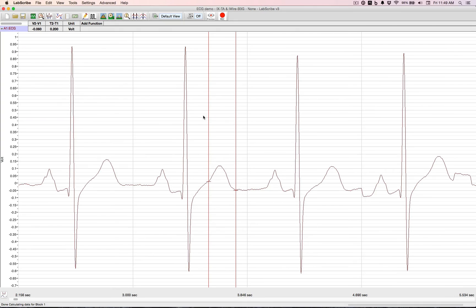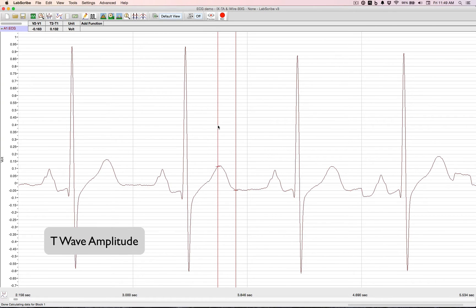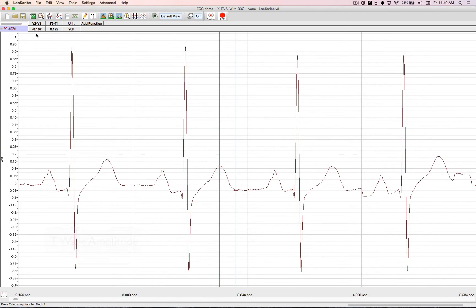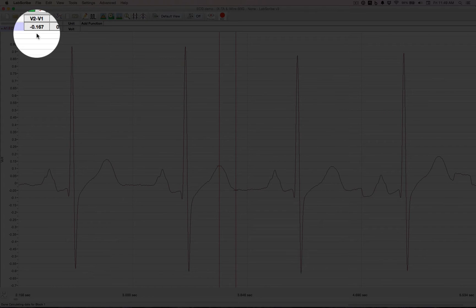And then moving the cursor to the top of the T, we can do a T wave amplitude. That's 167 millivolts.